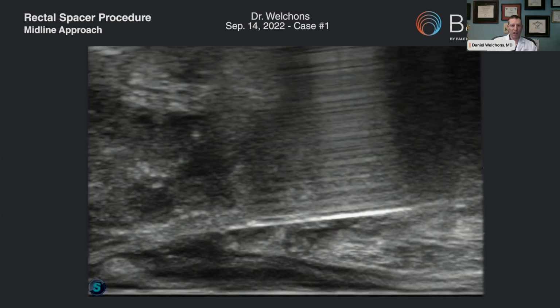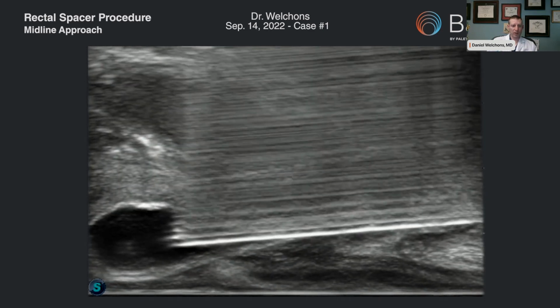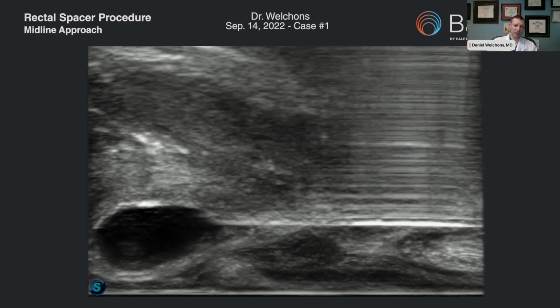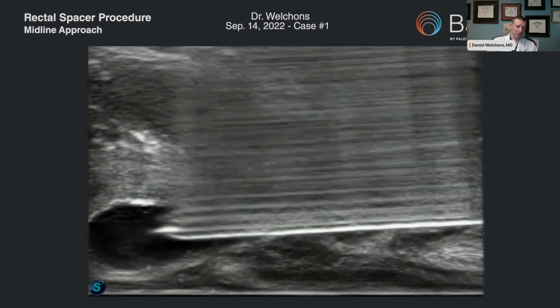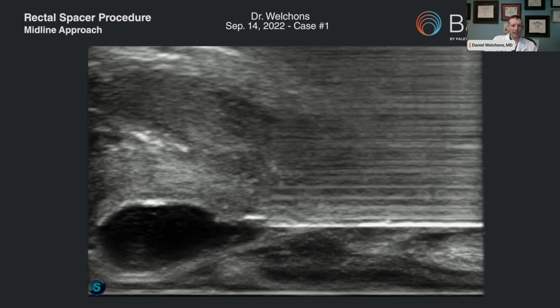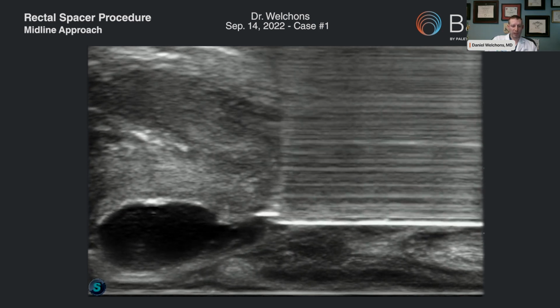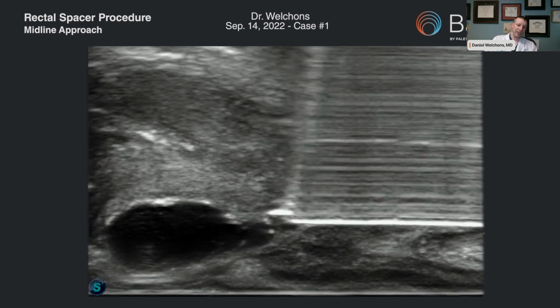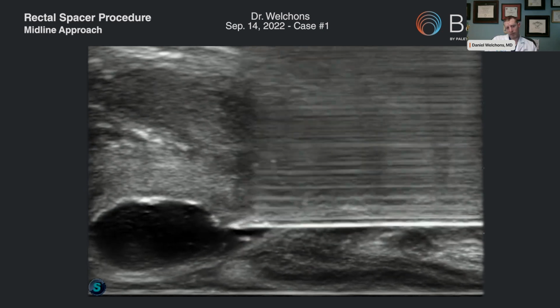When you're in that gel, you're safe. And so that's one of the key safety parts of this product, I think, is that if you're in the gel, you know you're safe. And so you can reposition yourself if it's more challenging. You can see I move the needle back, and then if it's not really going, or if I'm feeling some resistance, or I don't really like the position, I slide the needle back into the gel and then move it as needed backwards.